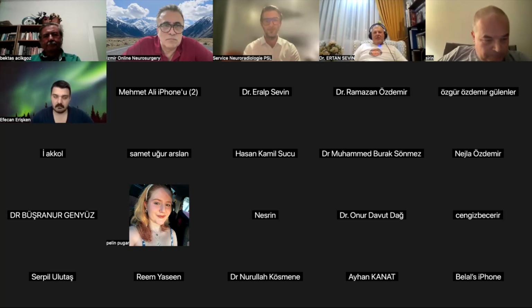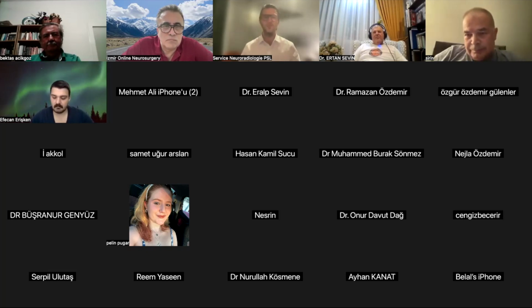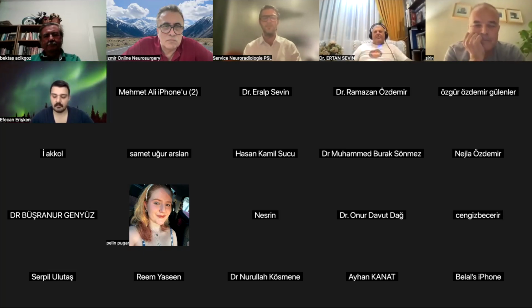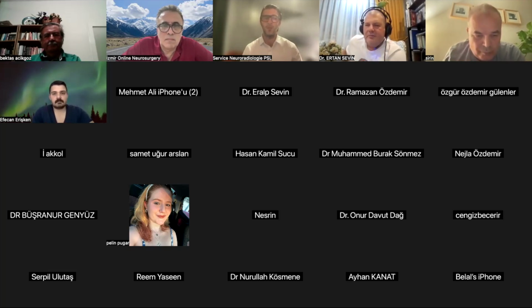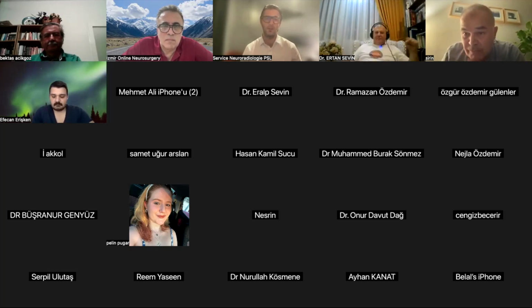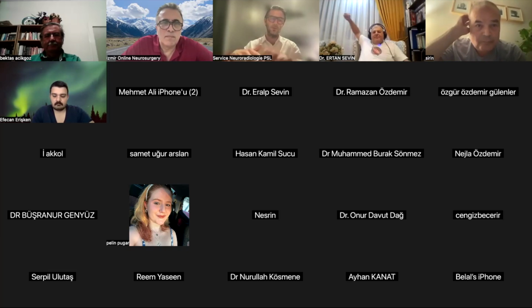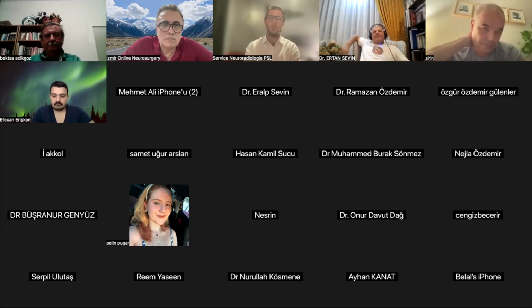And Professor Kamil Sucu asks, what is the brand or the name of the RF probe you use for the bone metastasis? You can use OsteoCool, which is dedicated to RF ablation of bone lesions, and we have also the RF ablation tool from Merit with the tips that you can curve and which will help to enhance the size of the ablation zone that you will perform.